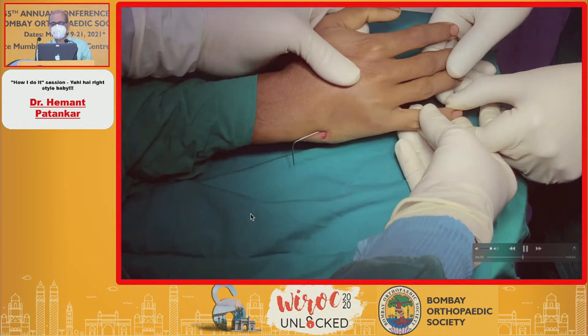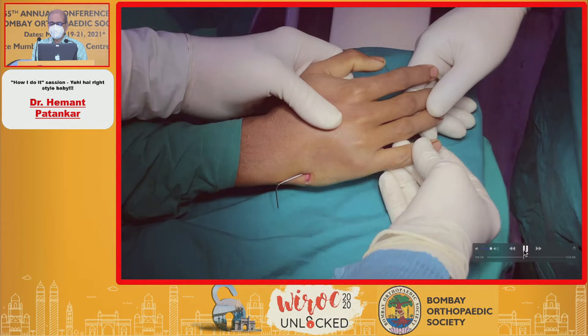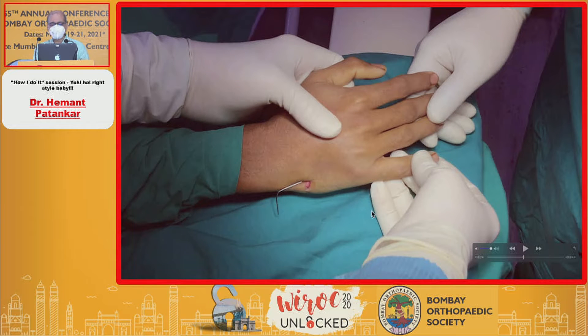The first K-wire is placed and kept in position. Once you are satisfied with its position, you cut the K-wire here — you cut it so that it does not rotate again while you are inserting the second, third, and fourth wire.